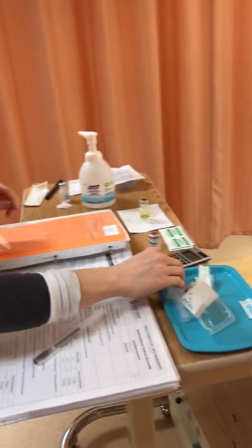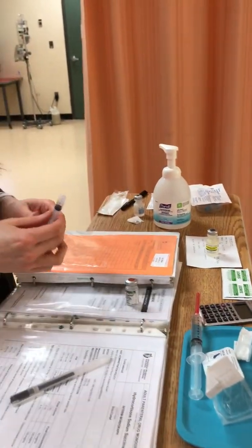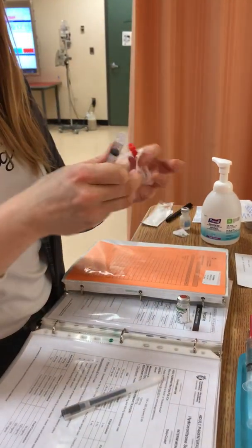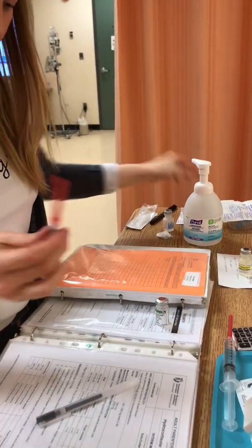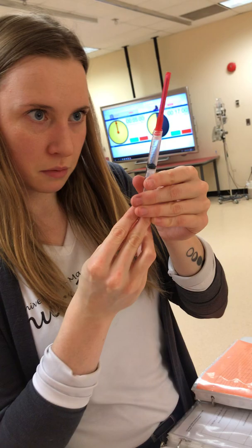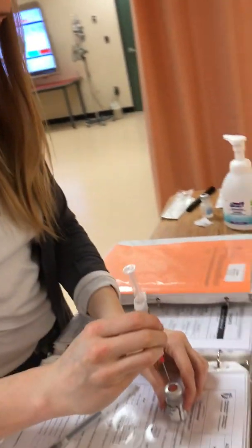Before I do anything else with this, I'm going to draw up my drug and then do my second check. So I've got a fresh Luer-Lok, attaching this, and I will be taking out 1.6 milliliters. I've swabbed and cleaned this and let it dry.